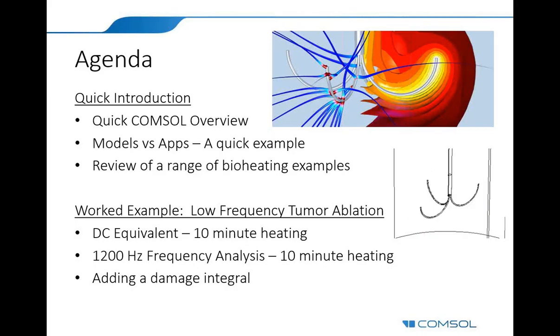But the industry also uses that for what I would think of as fairly low frequency things. So what we're going to do in these particular examples is look at a problem that we constructed out of the model library, and we'll start it at the DC equivalent. So we're running at a very low frequency, and then we'll do the RMS equivalent of a 10-minute run at a particular voltage, and then look at how that works. Then I'll switch it to an actual frequency analysis. So we'll change it from a DC equivalent to running things as an AC equation, in this case at 1200 hertz, and talk about that.